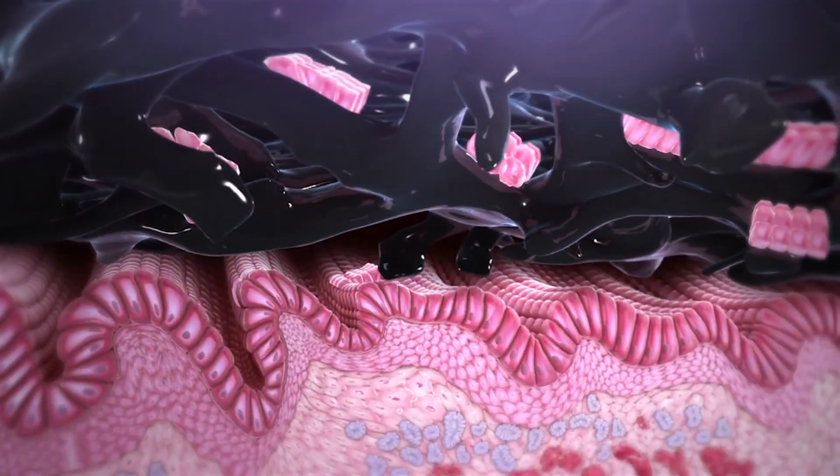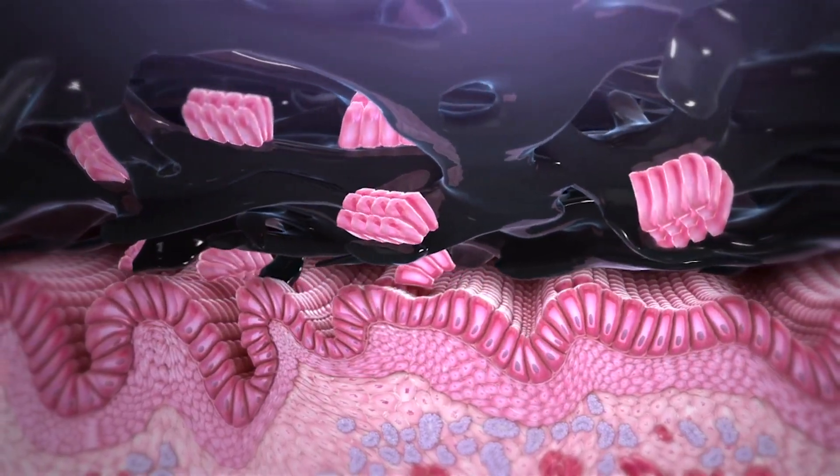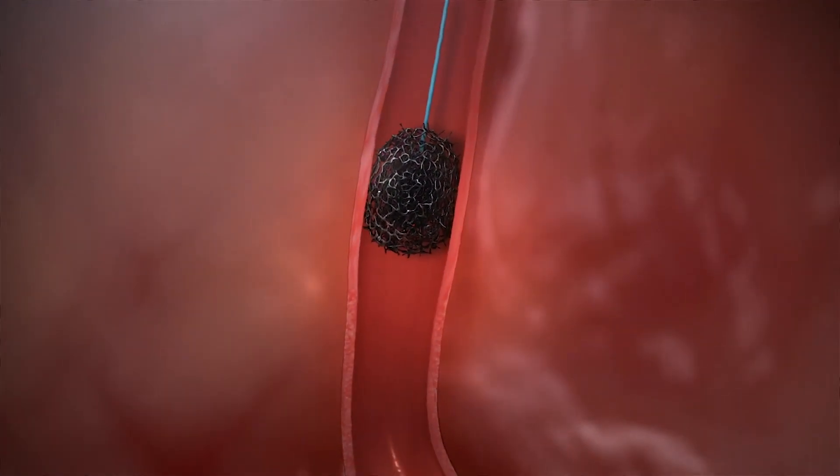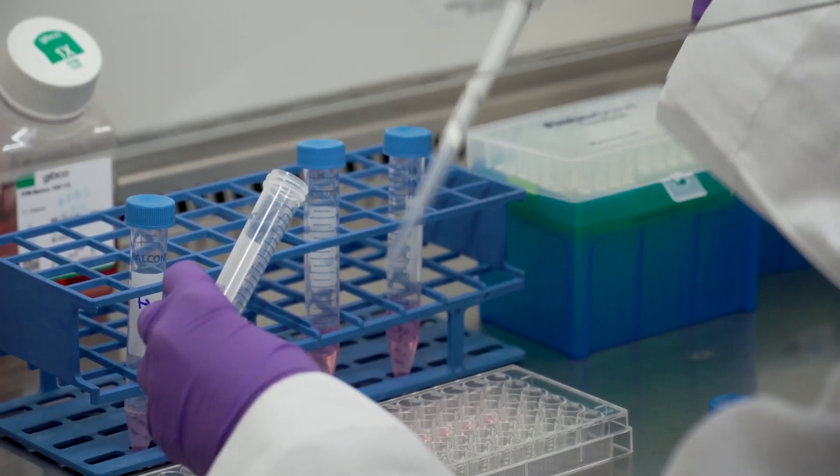The doctor then pulls the string. As we're pulling on the string, the sponge is touching the esophageal tissue and collecting cells, and it collects about 500,000 cells throughout the esophagus. The cells are then analyzed for any signs of cancer.